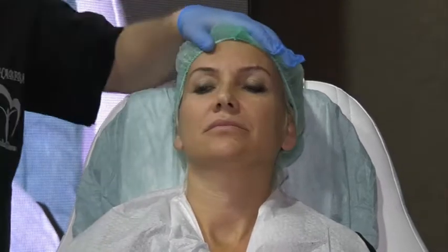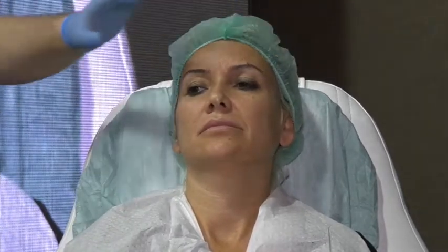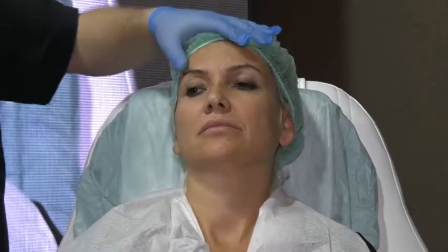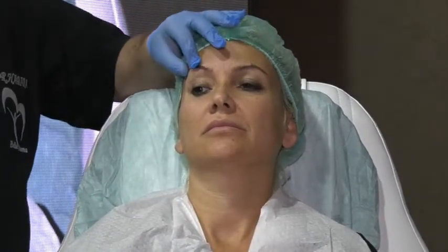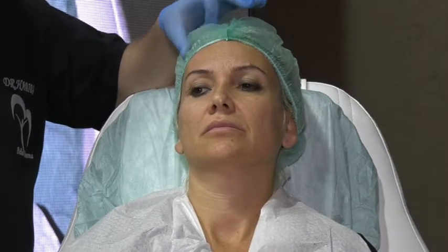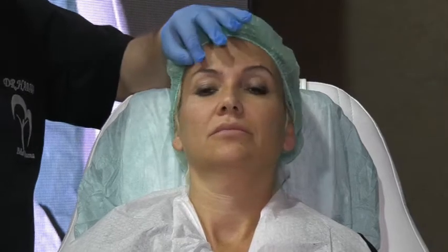If really I'm treating something, I have a small fold, I have a problem that his eyebrow is falling down, or it's only a cosmetic purpose. If it is only a cosmetic purpose, I have to ask the patient. I give her a mirror. We are assuming, by the way, so I'm giving her a mirror. Do we have a mirror? I have a small one. Okay, let me bring it.